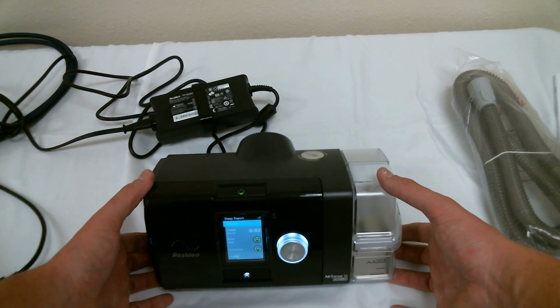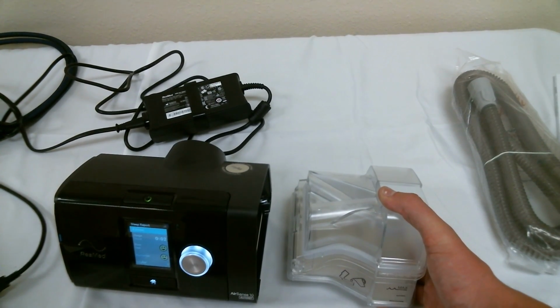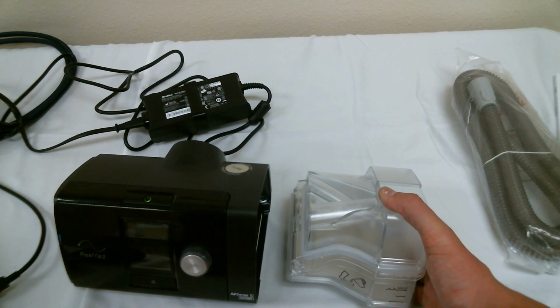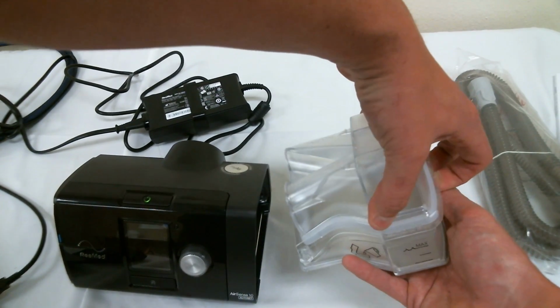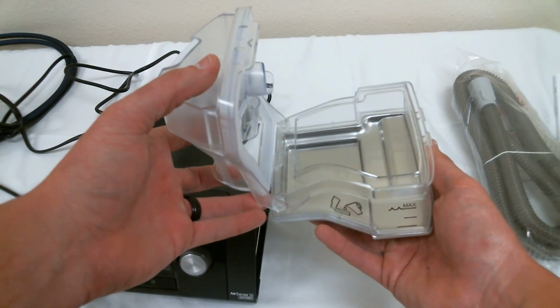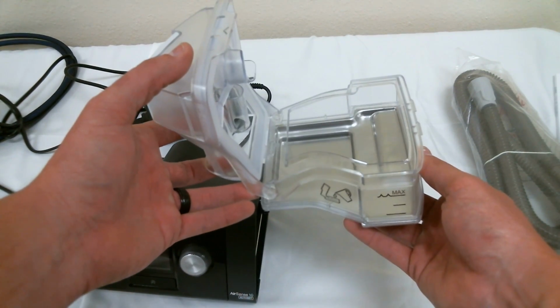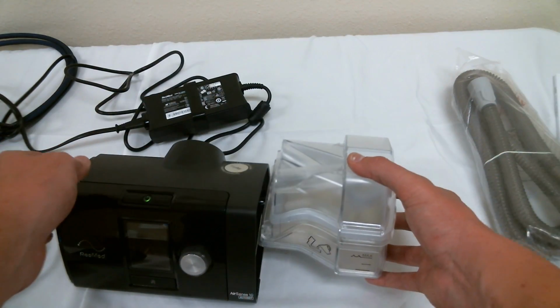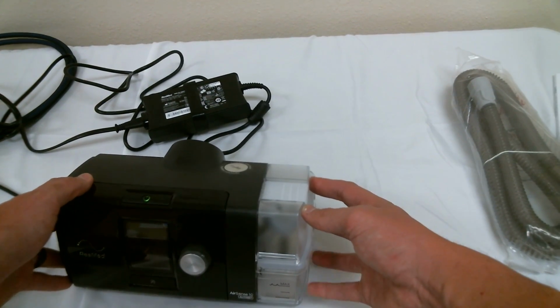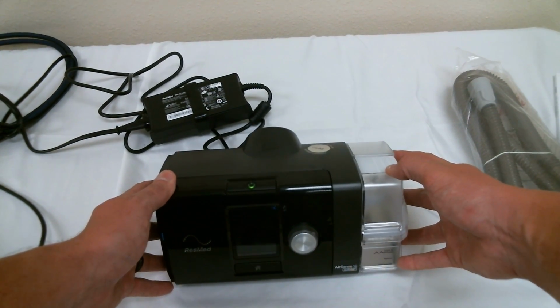Next, you'll want to understand your humidifier chamber. It's important to fill the humidifier chamber with distilled water before use and empty excess water after every use. You can easily fill, empty, and clean the chamber by removing it from the side and opening the chamber from the side. Be careful not to open the chamber more than 90 degrees because it can break off the hinges. To close, press down until you hear it click and slide back into your device. It must be inserted all the way into the device to avoid air leaks or device errors.